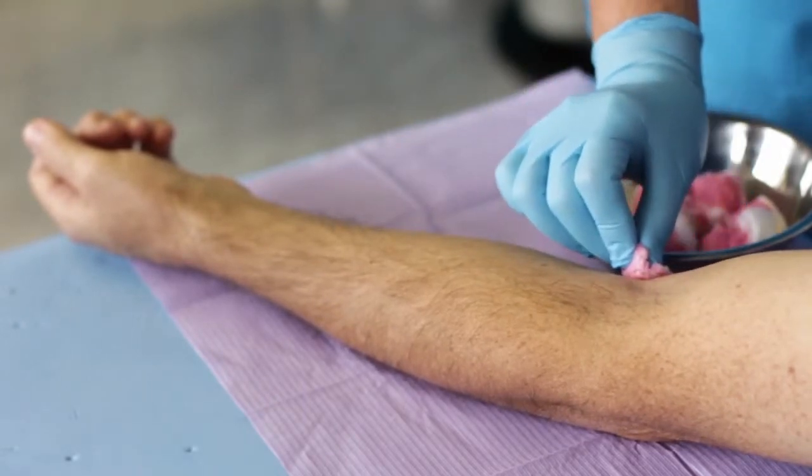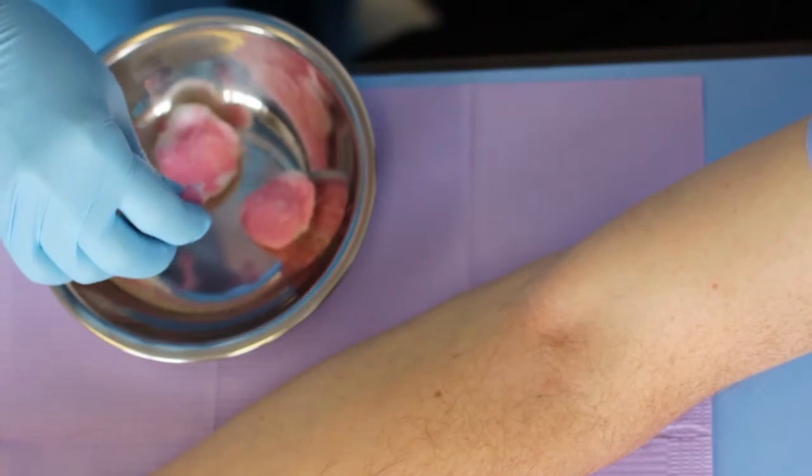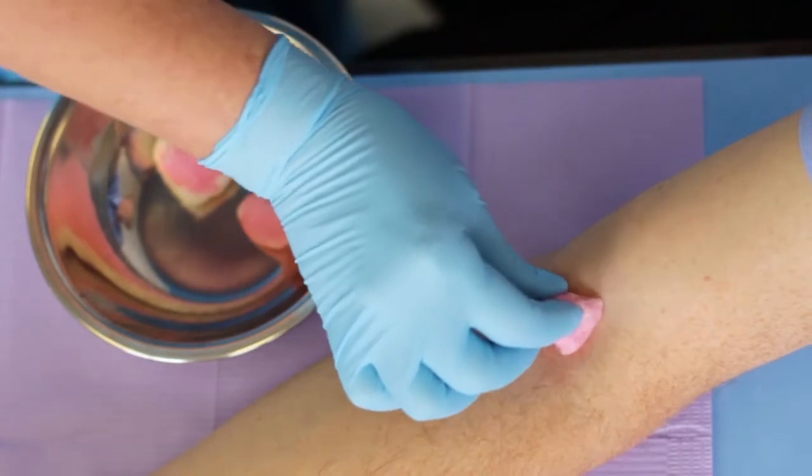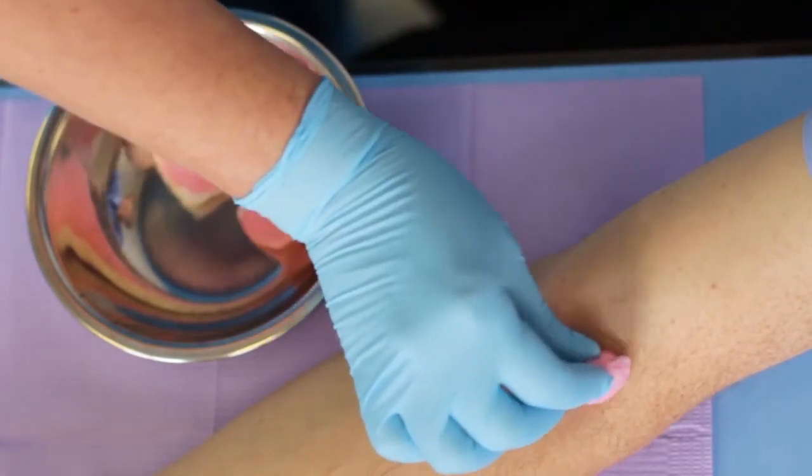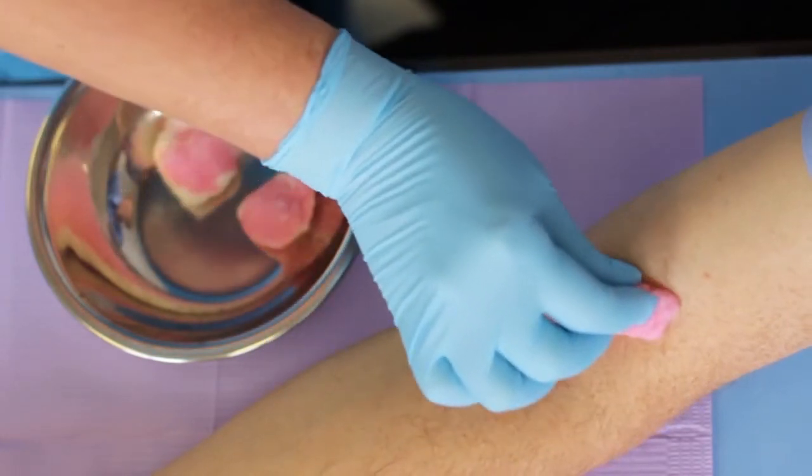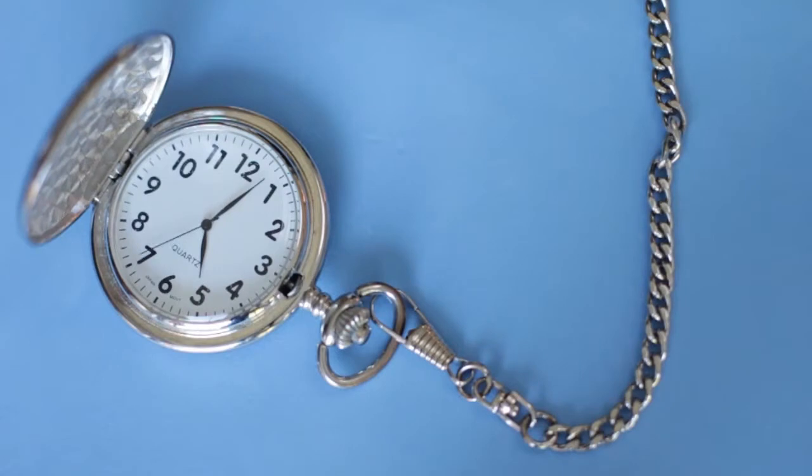Perform two to three scrubs using a fresh swab each time. For the last scrub, start at the intended puncture site and spiral out in a circular motion toward the periphery. Clean for a total of one to two minutes and then allow the site to dry for approximately 30 seconds.